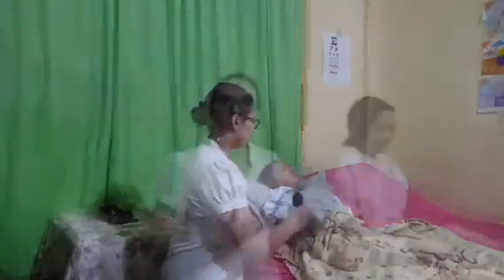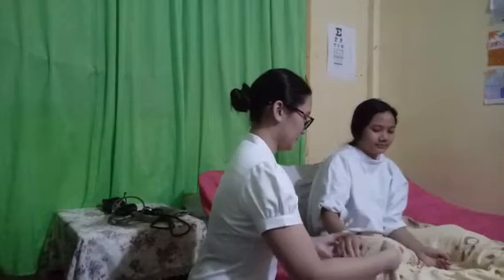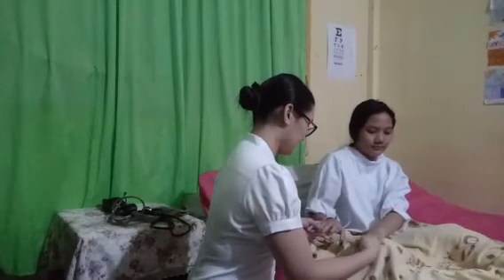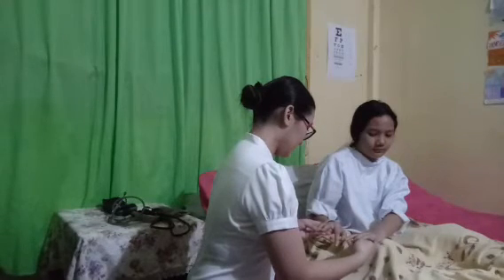Okay, so blood pressure of 100/80, which is normal. Now I'm gonna be assessing for the patient's capillary refill. Miss Yami, touch po sa. Okay, so good. There is an immediate return of color in 2 seconds.